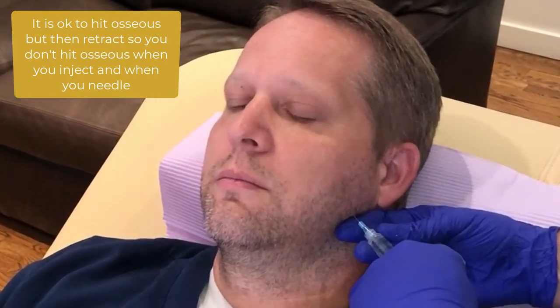Aspirate, I inject one third of the volume I'm going to inject — so in this case it's going to be one cc. Come a little bit anterior, aspirate, another third of the cc. A little bit more posterior, aspirate, another third of the cc.